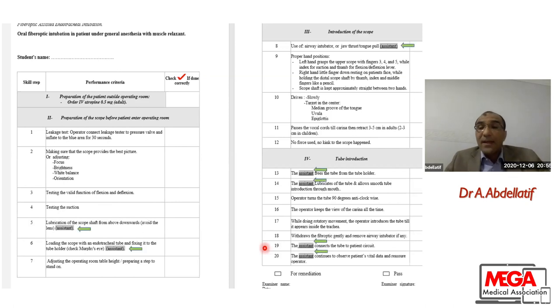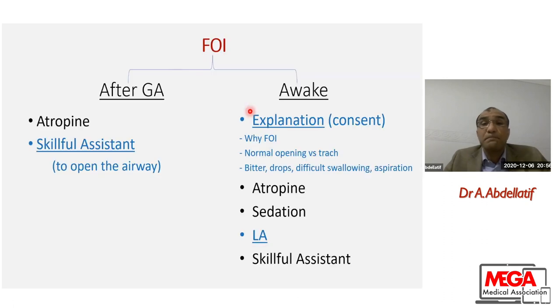Here we emphasized the role of the assistant, because this is teamwork and no one can do fiber optic intubation without the help of a skillful assistant. That's why we emphasized the role of the assistant in this checklist.